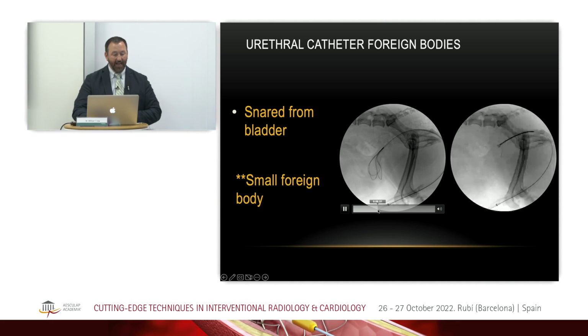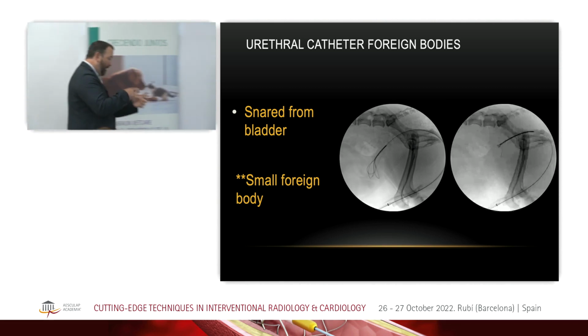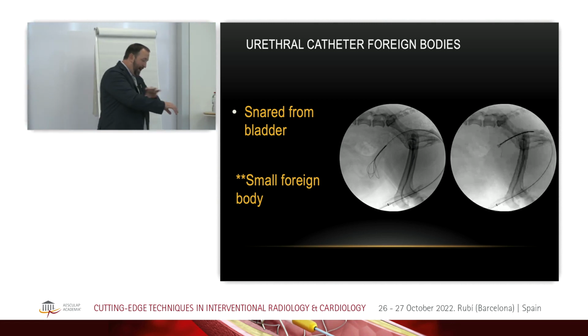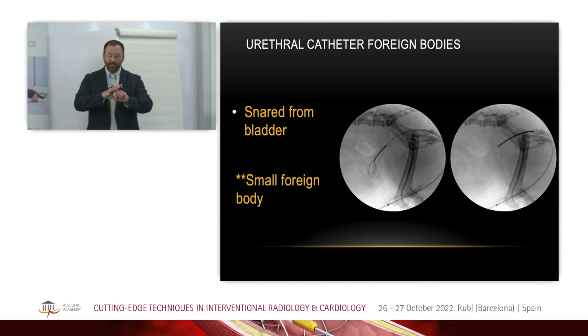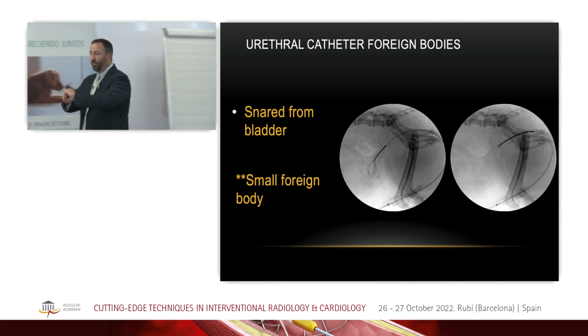I pass that catheter over top of it. And so your snare's there, your foreign body is just sitting through the arms of that snare. As you pass that catheter down, it's just going to close the snare down. Basically, as long as your foreign body is sitting through that snare, if you pass the catheter over top, it's going to close it down and engage that foreign body.